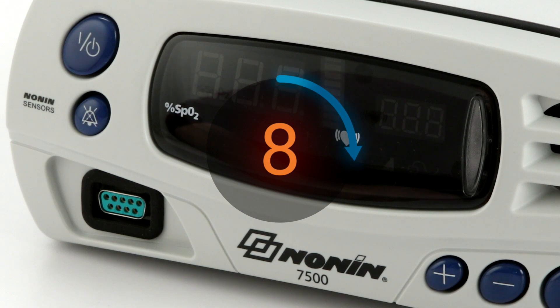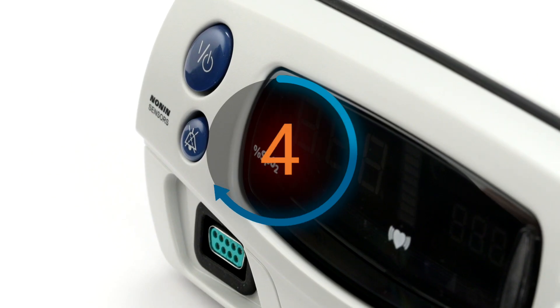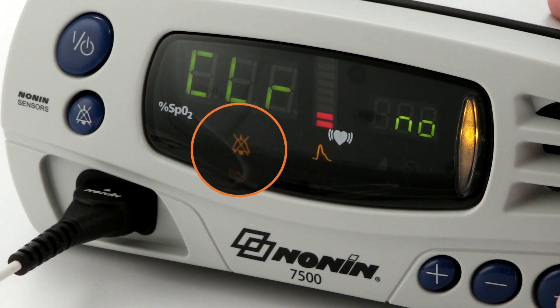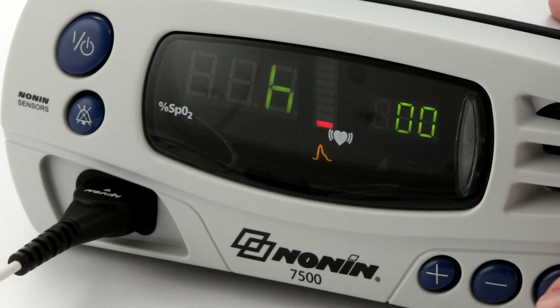Wait 10 seconds and power it back on. If the elements still do not appear correct, remove the unit from use and return it for service or repair. If alarms are enabled, they will remain silent for two minutes at startup to allow time for sensor placement or setting adjustment. Check the oximeter's time settings for accuracy during the startup, and reset the oximeter in setup mode if they are not accurate or appear as zeros.